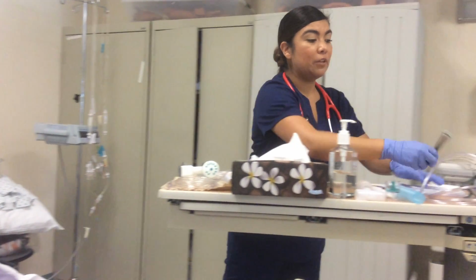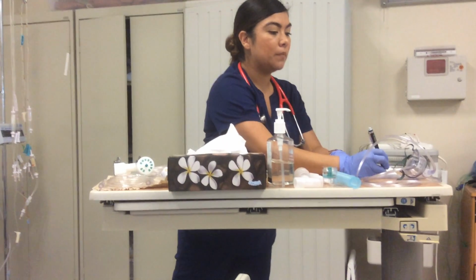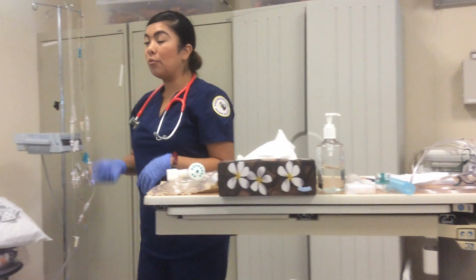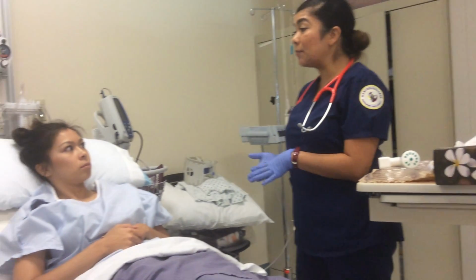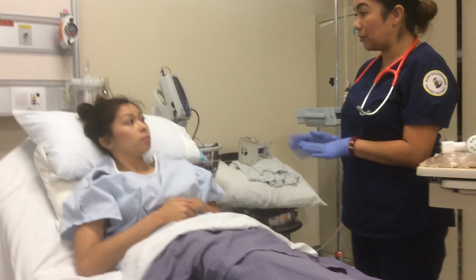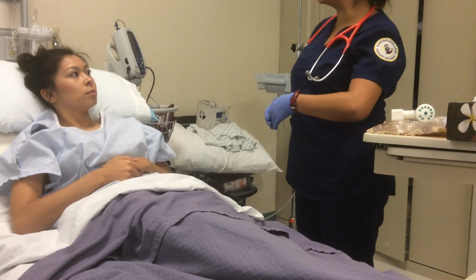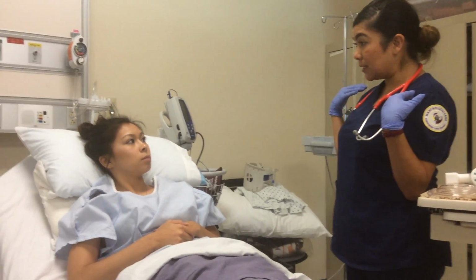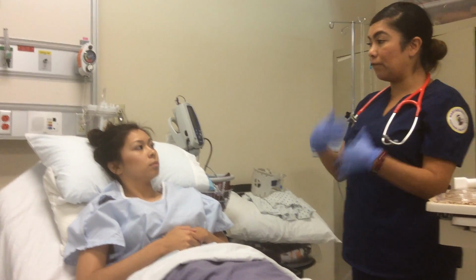Do you have any questions for me so far? No problem. Okay, so now I'm going to listen to your breath sounds. Is that okay with you? What that's going to consist of is I'm going to listen to the back of your lungs, or your back side, and then your front side.